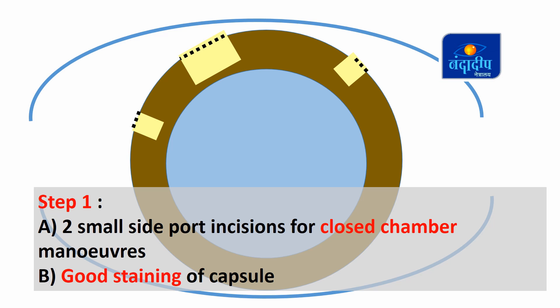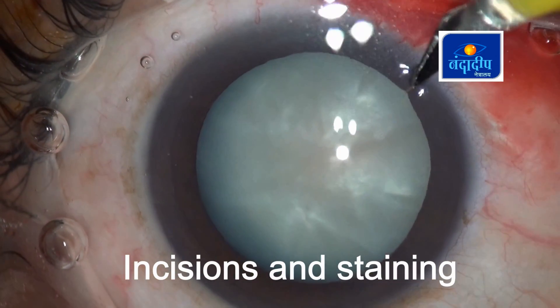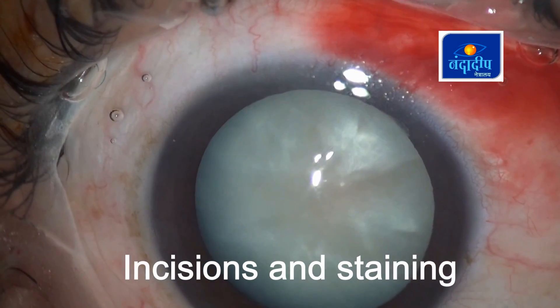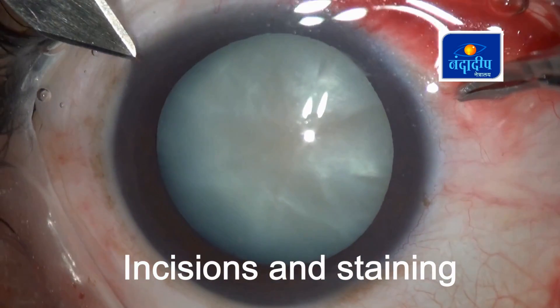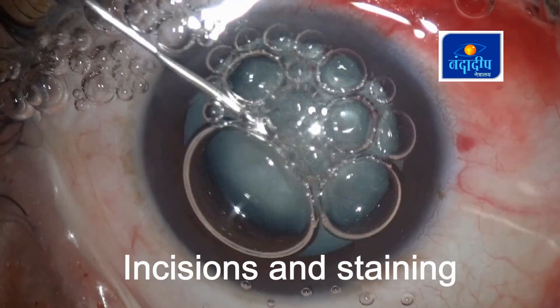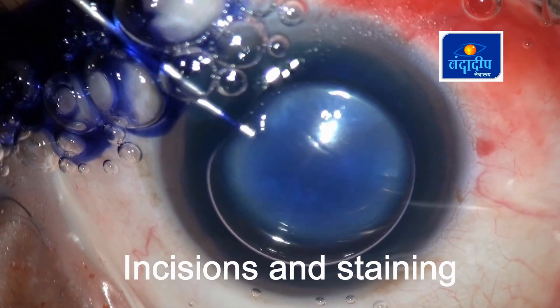Step 1: First, we have to create two small side port incisions for closed chamber maneuvers, and then do proper staining of the anterior capsule. Creating these two small side ports helps us have controlled maneuvers in the anterior chamber because viscoelastic will not come out through the small incision. A good staining of the capsule under air using trypan blue is important because this staining makes the capsule a little bit thicker and easier to maneuver. This is how we stain the anterior capsule using trypan blue for 20 to 30 seconds.